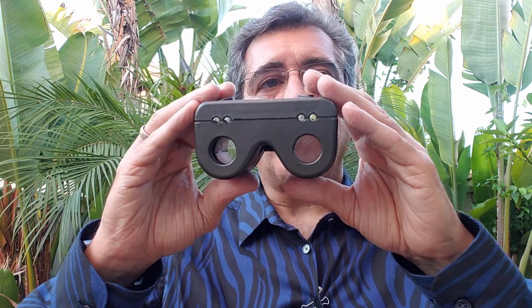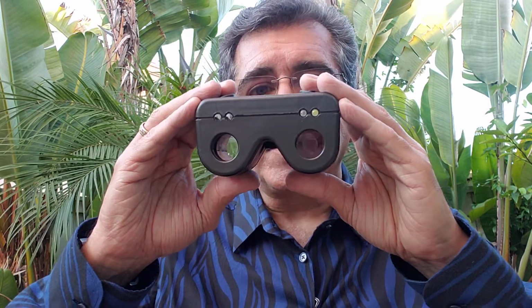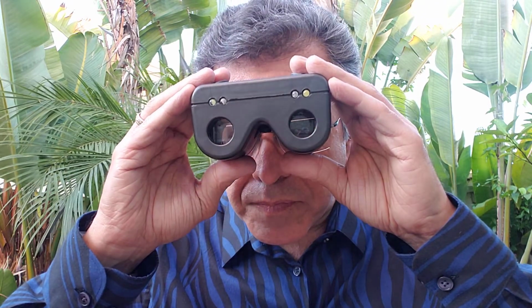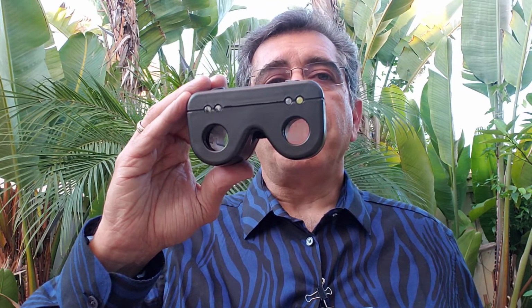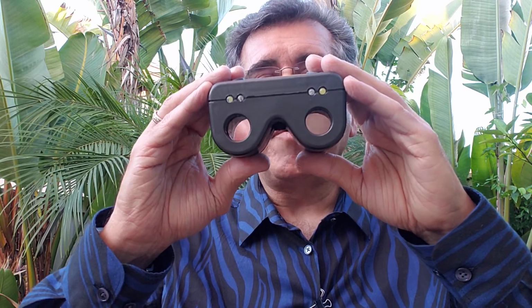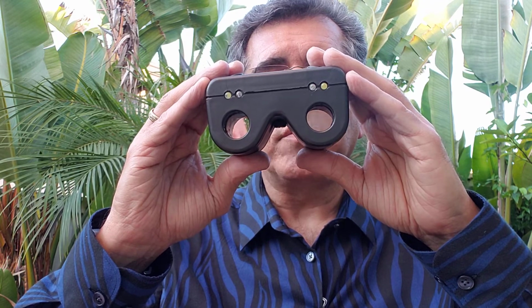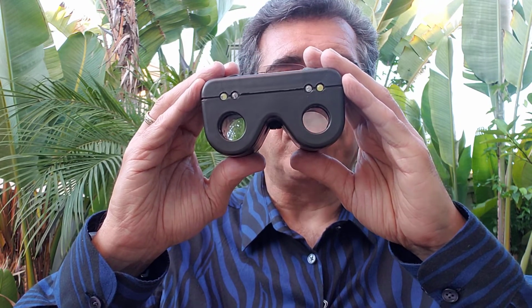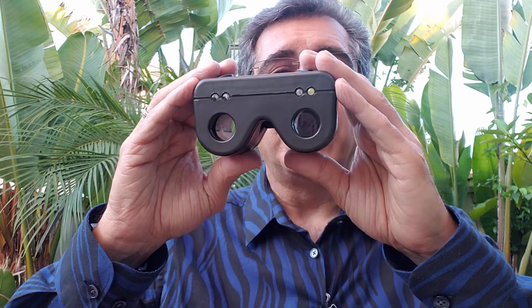Press the button for one of the LED lights and observe the direct response. Leave it on for about a second and then turn it off. You will see the pupil constrict, and then as you let go, the pupil returns back to the state that it was before.